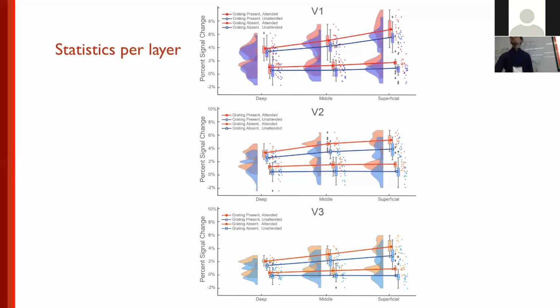But experimental design is hugely important. I think what you want to do is not just measure a slope compared to something else and see that they differ. For your acquisition, your voxel size, your echo time, what slope would you expect to see if there's no effect? And how would you compare that slope against what you see in your metric? That slope is going to vary. So there are some very clear results that would be interpretable, like that V, but if it's not that, then what is interpretable? That's difficult.